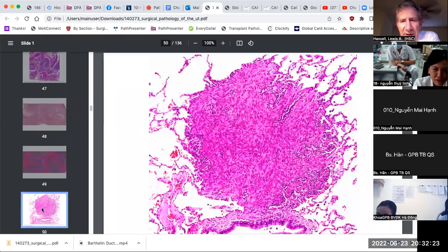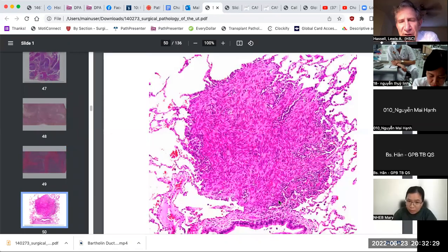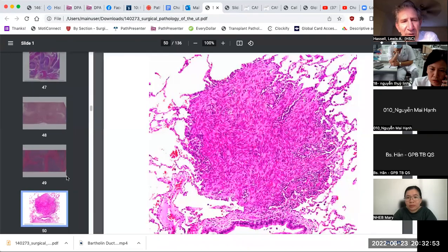Now we know that these tumors, leiomyomas, do spread, and that intravascular leiomyomatosis may be one of the precursors of benign metastasizing leiomyoma here in the lung. You can see a very benign appearing area of smooth muscle extending out a little bit along the interalveolar septi. This is a benign process. It's associated with that intravascular leiomyomatosis.